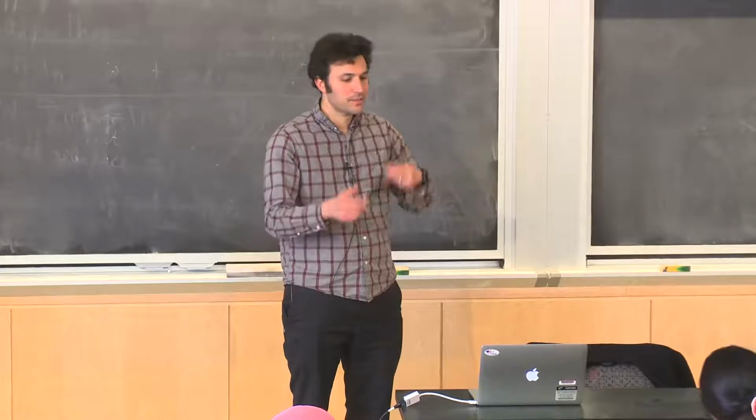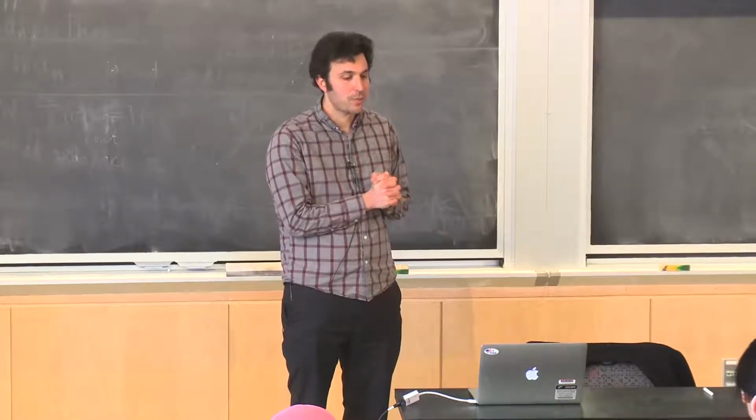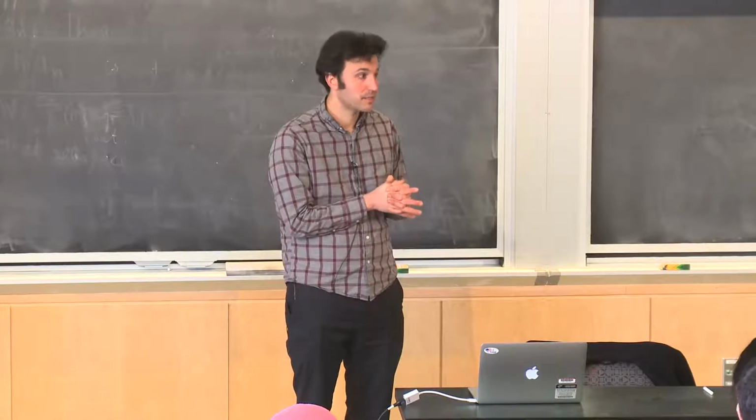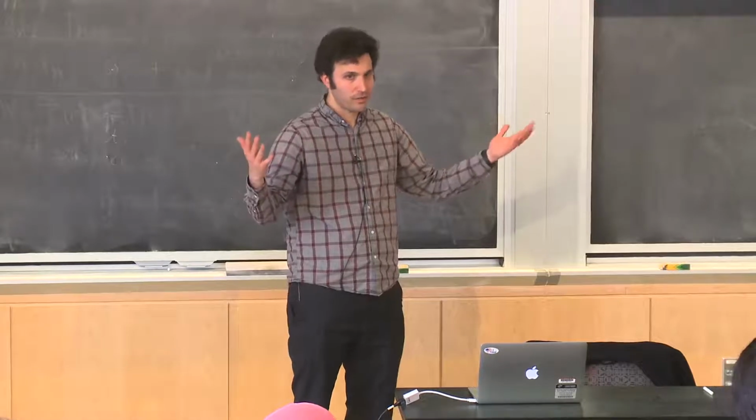In our experience, the sampling piece of the training should almost be thought of as another parameter to optimize when you're dealing with a problem where you have humongous slides and you can't use all the training data.